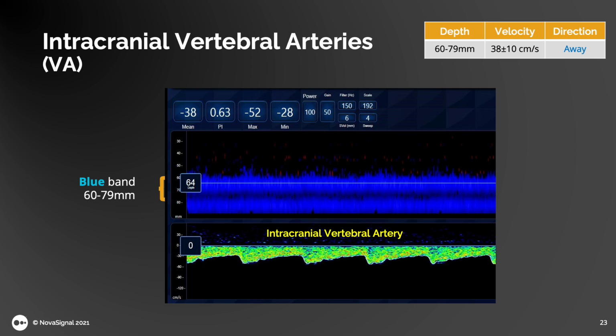It's important to note when we are evaluating for the basilar artery, there are 3 windows through the back of the head: left, middle, and right. In 75% of us, we are left vertebral artery dominant, so that is the best window to use to insonate the basilar artery most of the time. However, if you use your M mode, you can figure out which window is best.